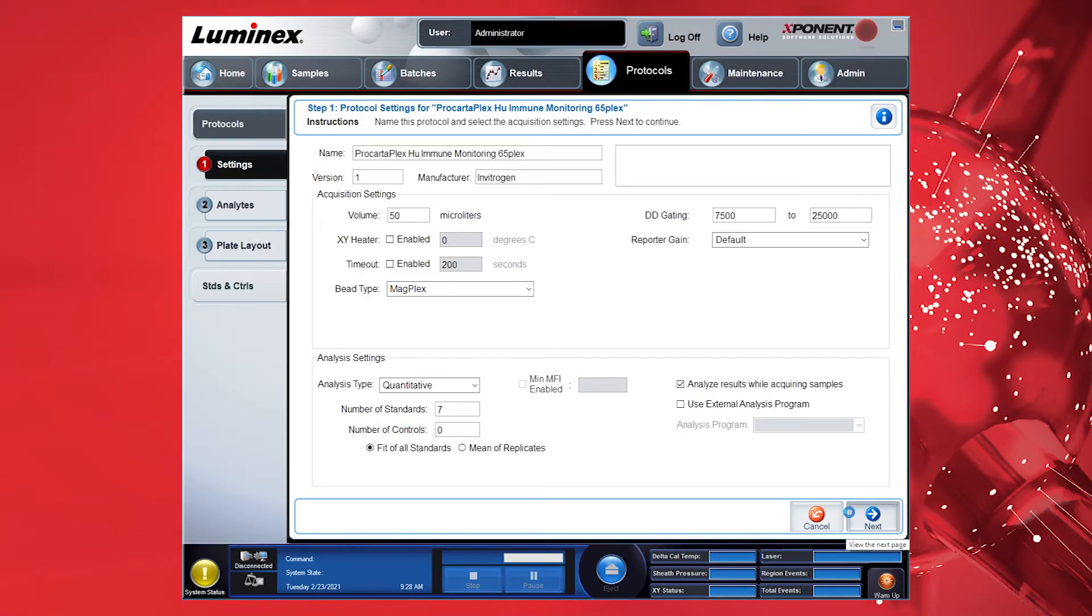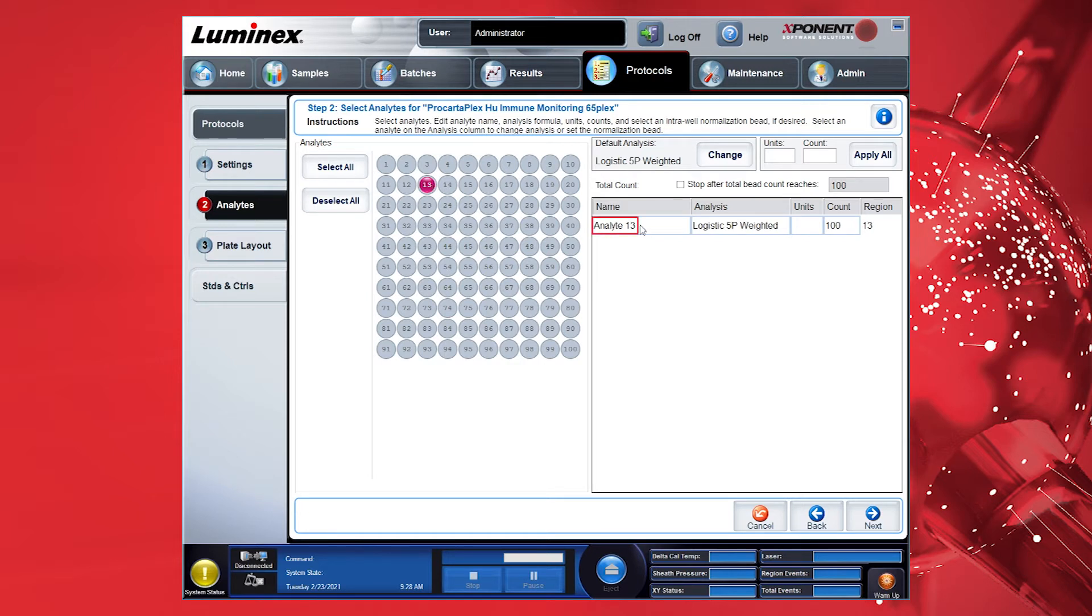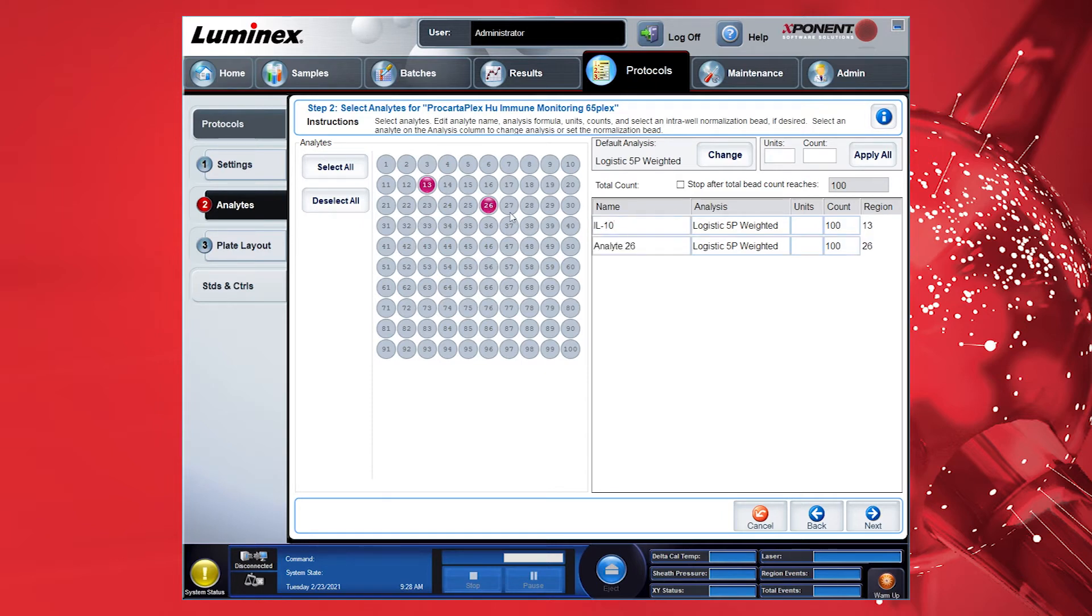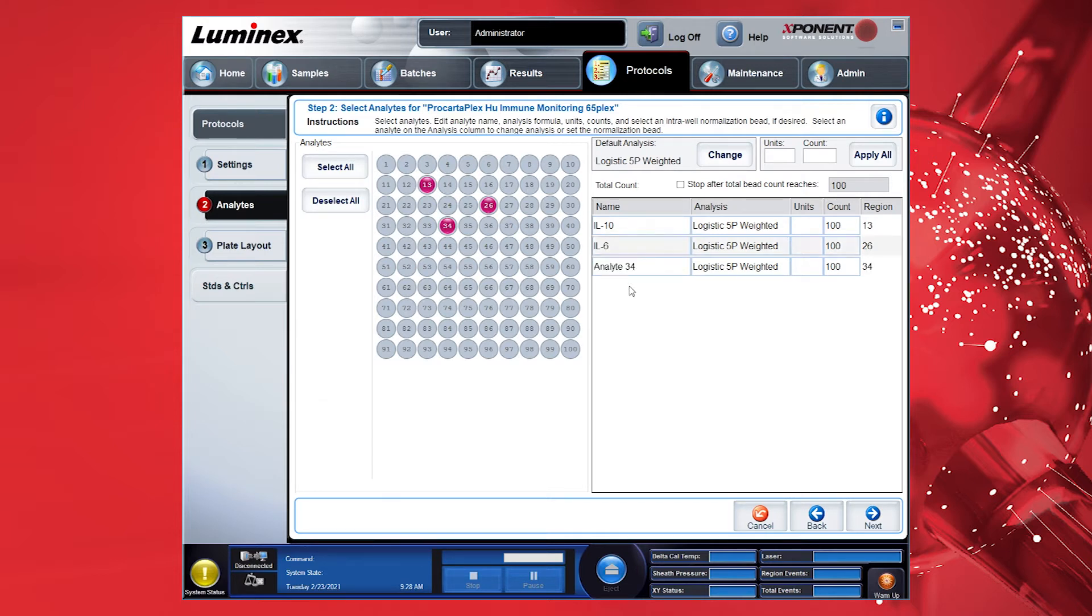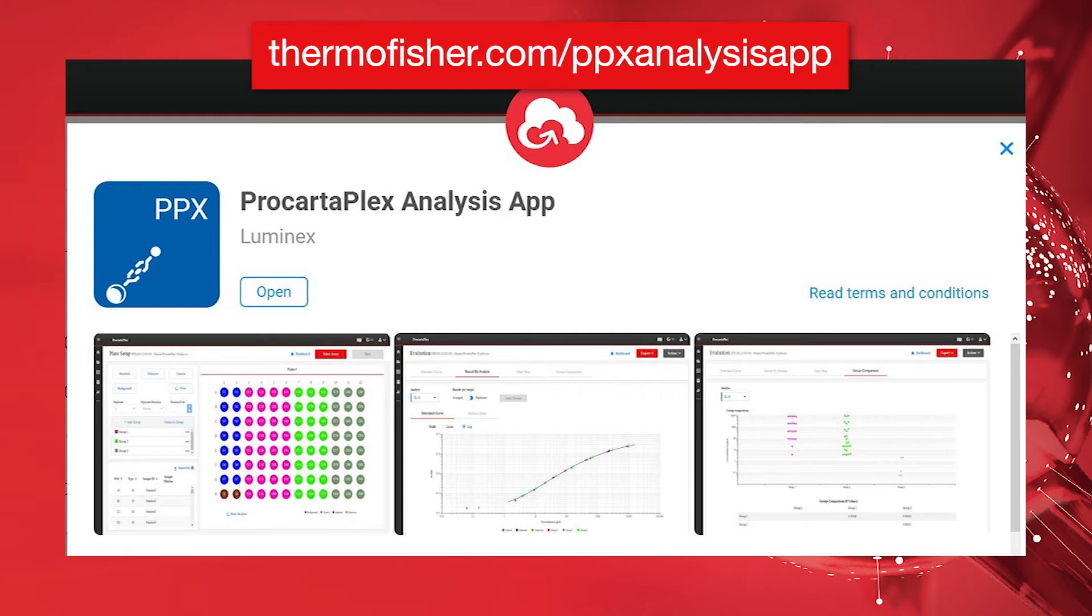Now select analytes on the left side to define your targets. Assign the bead regions according to the Certificate of Analysis by clicking on the bead numbers. Manually enter the names for each analyte in the list on the right. A benefit of using the ProCartoPlex analysis app on the Thermo Fisher Connect platform is that the analyte names will be automatically assigned. There is no manual entry required. This applies to all ProCartoPlex assay panels.